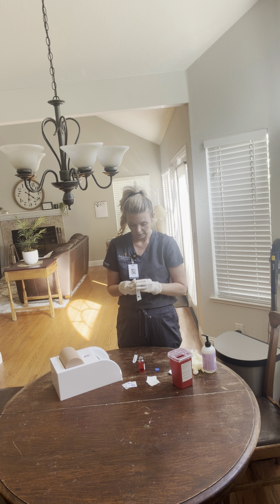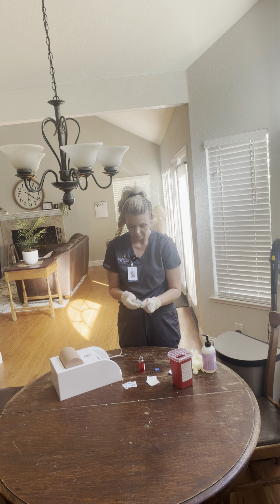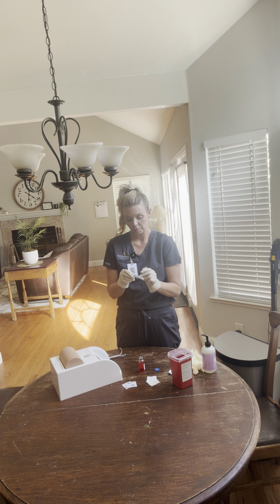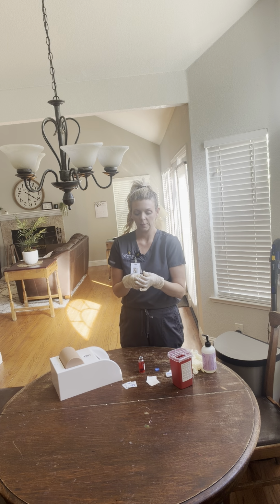Again, this is a 3 milliliter syringe, and I have my 22 by 1 inch needle. So I'm going to uncap that and twist that on and get my trash out of the way.